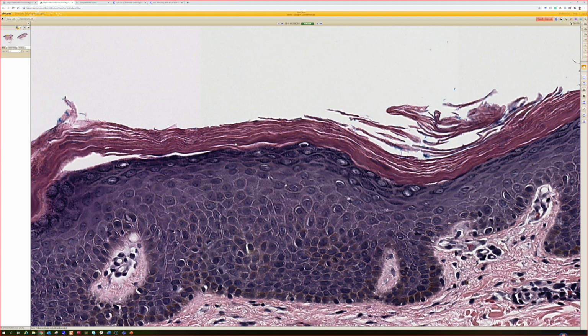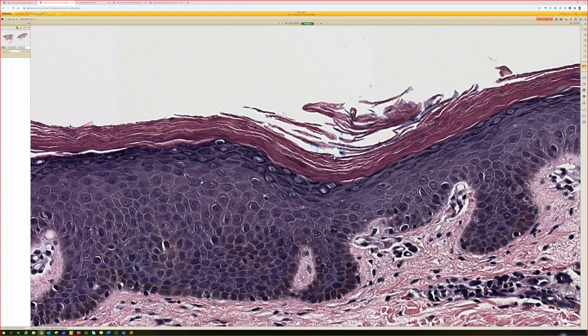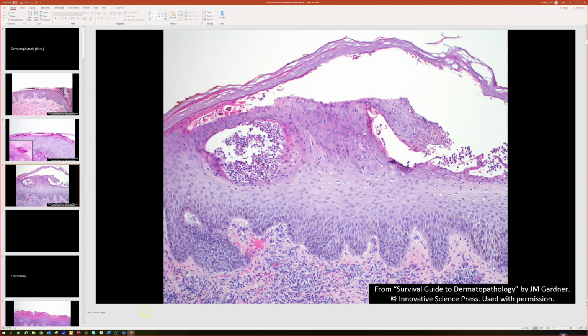But PAS I pretty much routinely do in genital skin for rashes, unless I see obvious lichen sclerosus or something like that. Because again, it's an easily treatable thing that you can solve the problem right away, and otherwise it's going to be a difficult-to-treat problem. So with this compact ortho, look for Candida, look for dermatophyte, look for erythrasma. Here's an example of erythrasma.